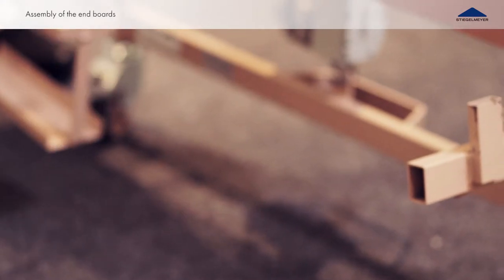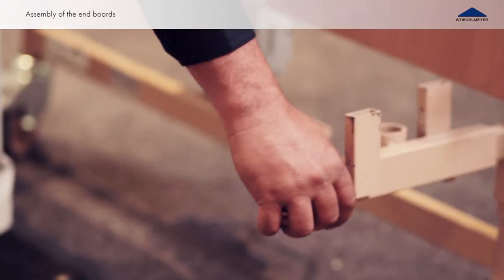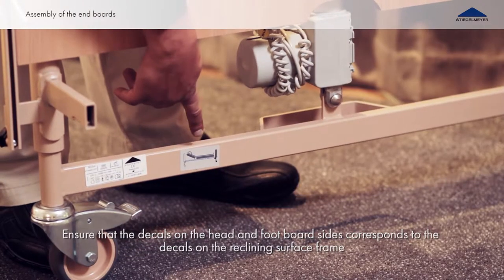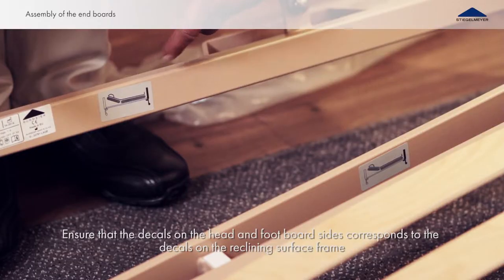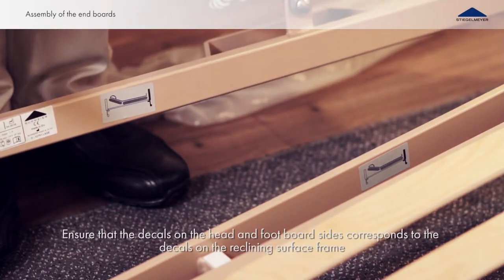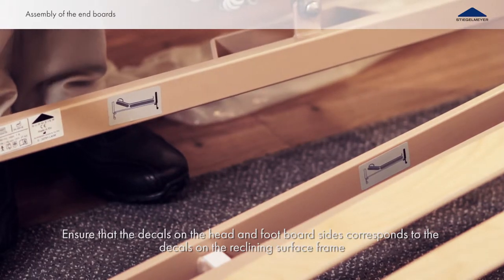Remove the two transport aids from the footboard. Check decals on the frames of the head and foot boards to match them up with the corresponding decals at the head and foot sides on the reclining surface frame.